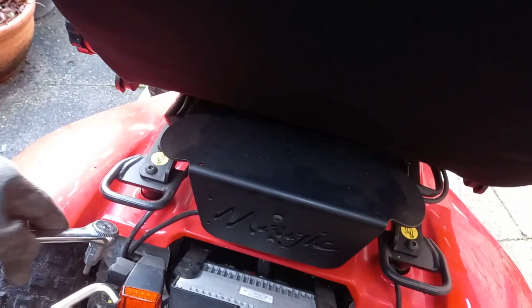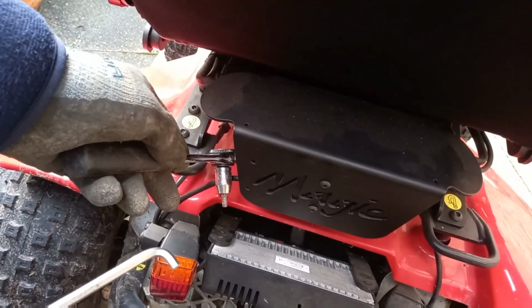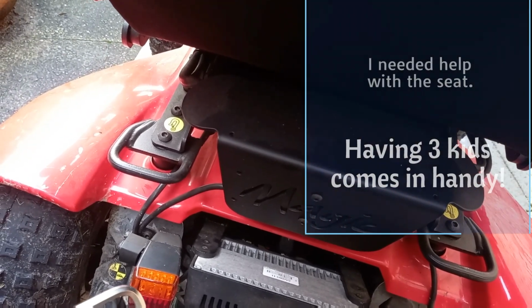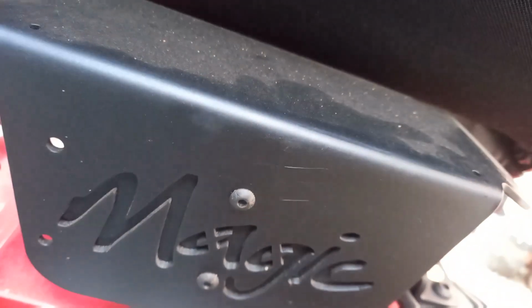But we're not quite ready for that, because we've got to disconnect this other indicator here and this controller lead, and then we should be able to take the fasteners off the seat, and it's loose then and then we can lift the seat off onto the table. We've disconnected the indicators and the controller lead out of that module there.